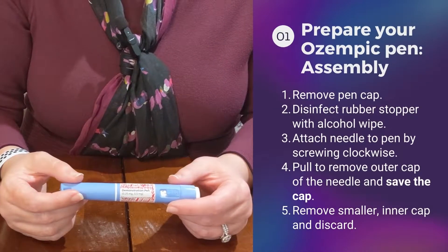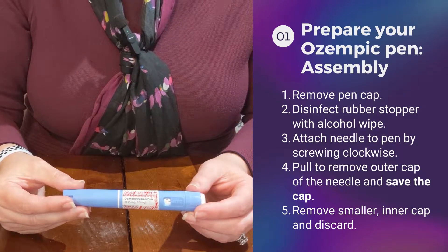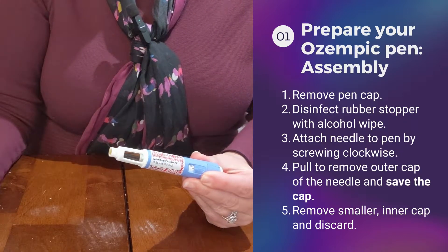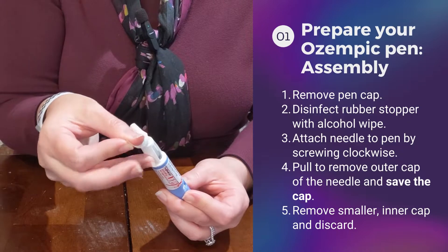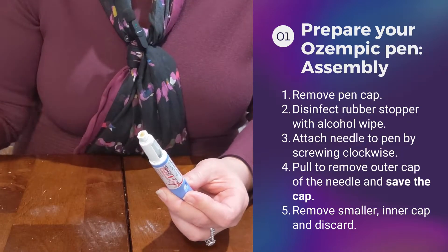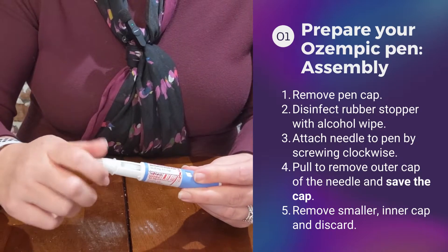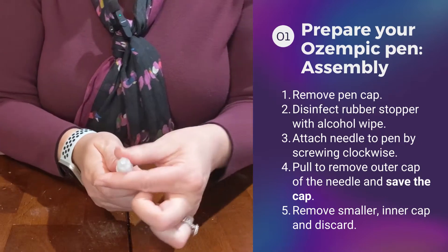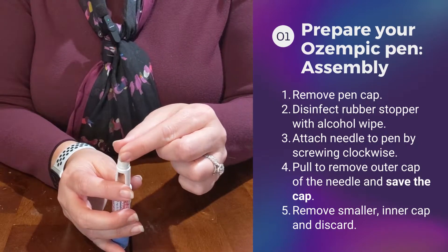Prior to giving your Ozempic injection, you have to prime the pen and make sure it's ready for injection. To do that, you're going to remove your pen cap. You're going to take an alcohol swab and apply alcohol to that rubber stopper. You're going to grab your pen needle and attach by screwing it on. Make sure it's tightly secure. You're going to take off the outer cap, and then be sure to remove the inner cap.